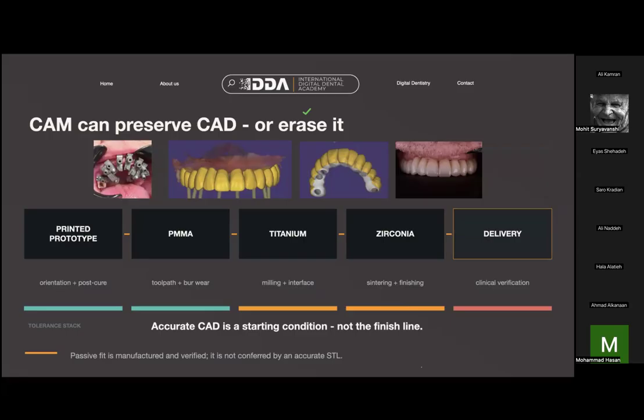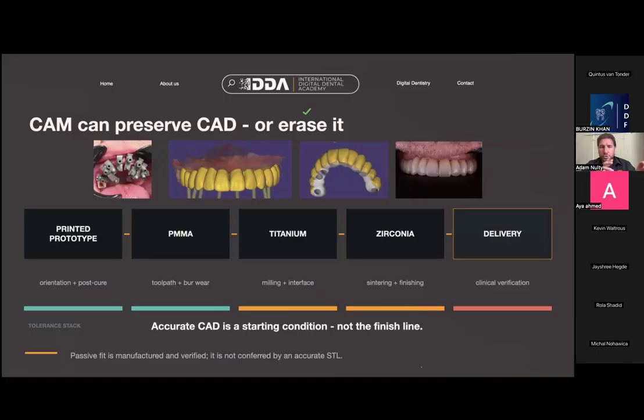And so, like always, you get what you pay for, but more really, you need to understand not just the starting position, not just the goal of the end position, but where all of these processes fit in with the digital workflow that we have, no matter what technology you're using to record the implant position. So understand that and work with the lab.